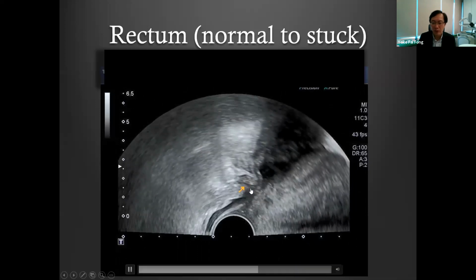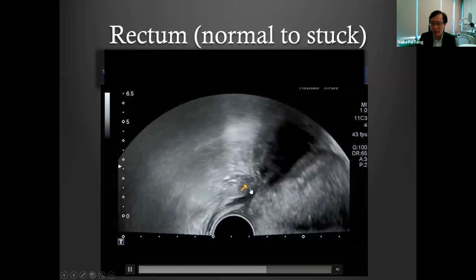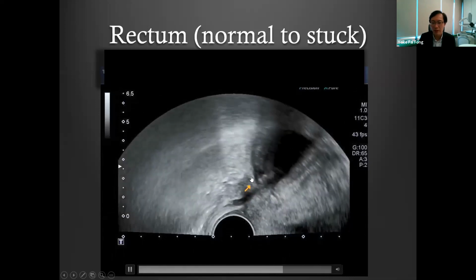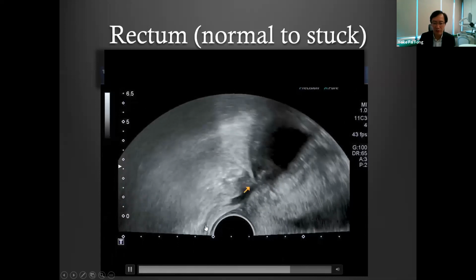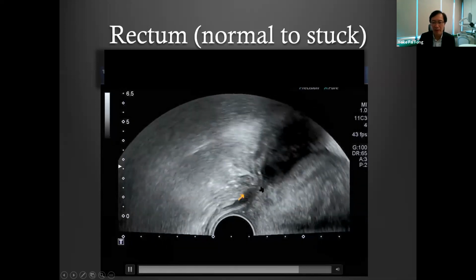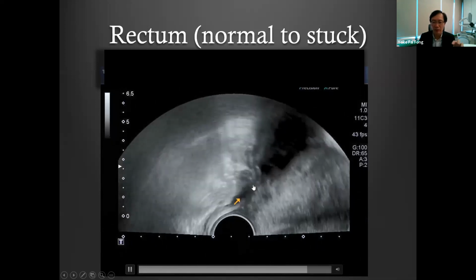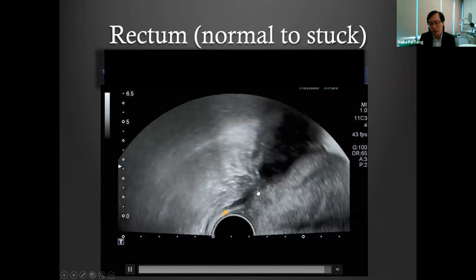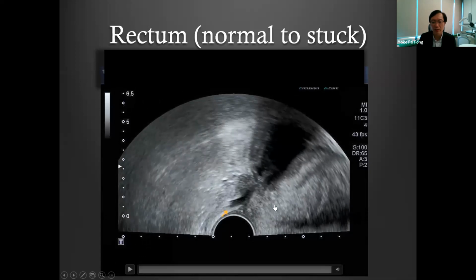Right, but here, once you go up to the mid rectum, it is stuck over here, right? Yeah. Okay. Yeah, this is stuck over here. Your rectovaginal septum is actually free. This part here is free, but this is stuck. Okay? You got a nodule resting on the rectum that is stuck to the back of the uterus, in the lower uterus, mid uterus area over here. Okay.